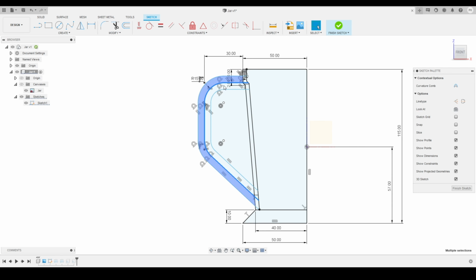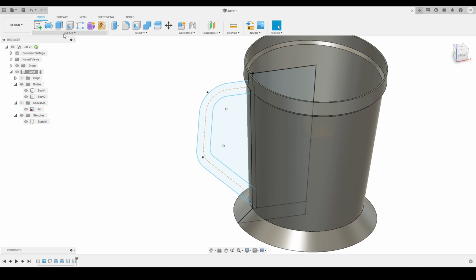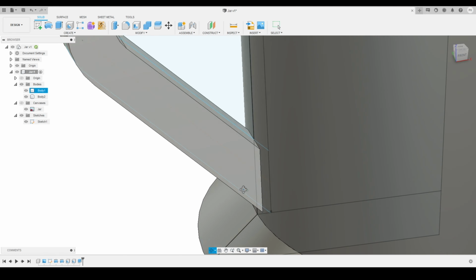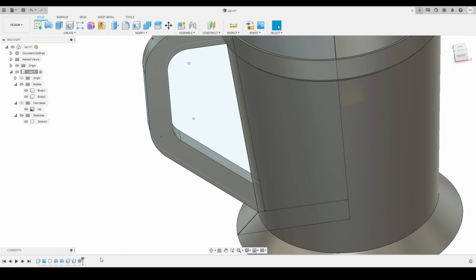Here you can see I have just completed all the profiles, and I will make sure that I change the center one to a construction line and click on finish the sketch. Here you can see, and now I will activate my extrude tool from here and select the profiles that I want to extrude. I will change here to symmetric, and then I will specify the distance and press OK. So here you can see the profile got extruded in both directions symmetrically. So I will change here to join. So here you can see this is what we got, but still it is not good, it is not touching the face.